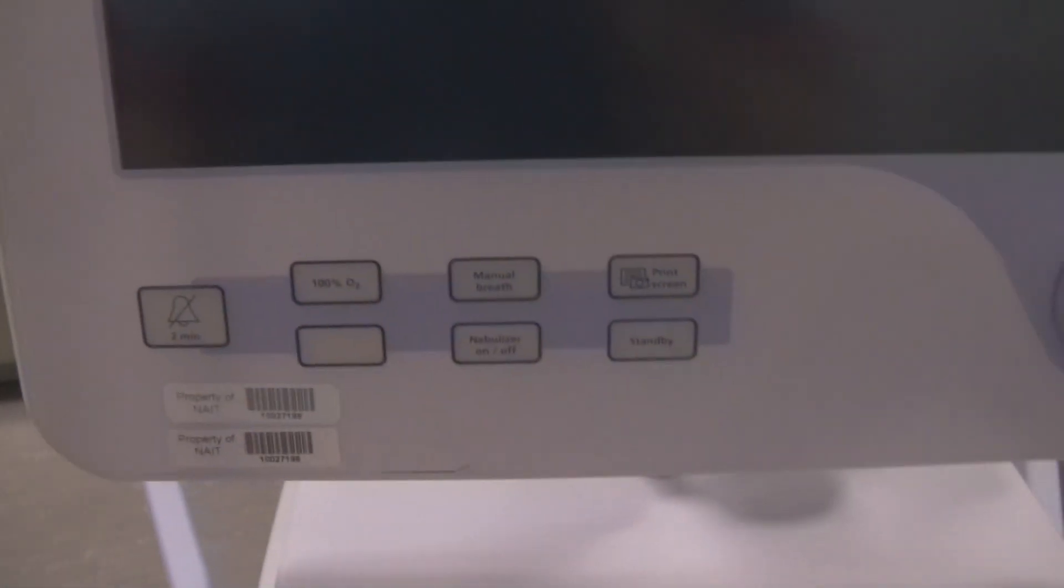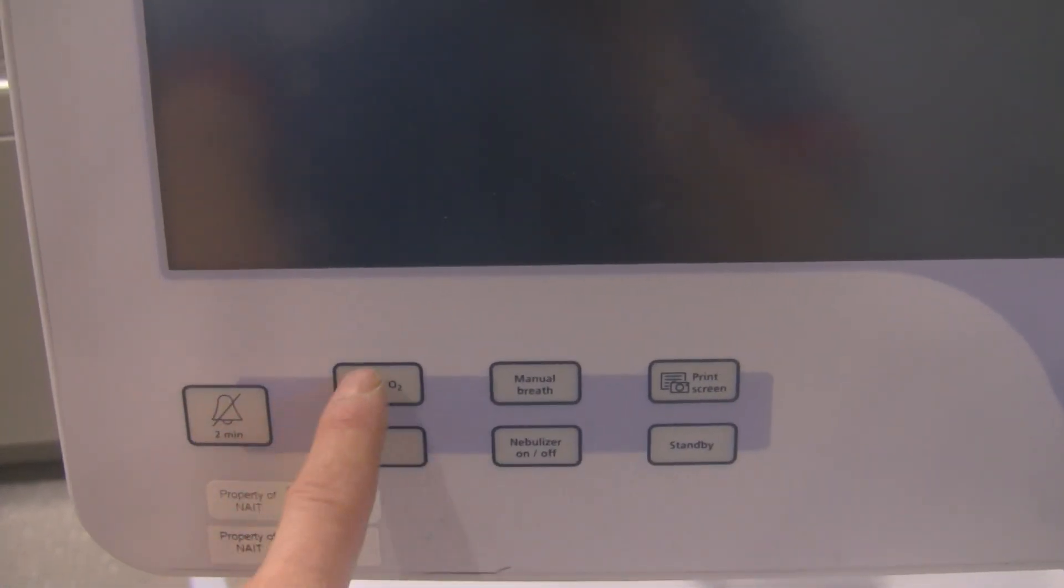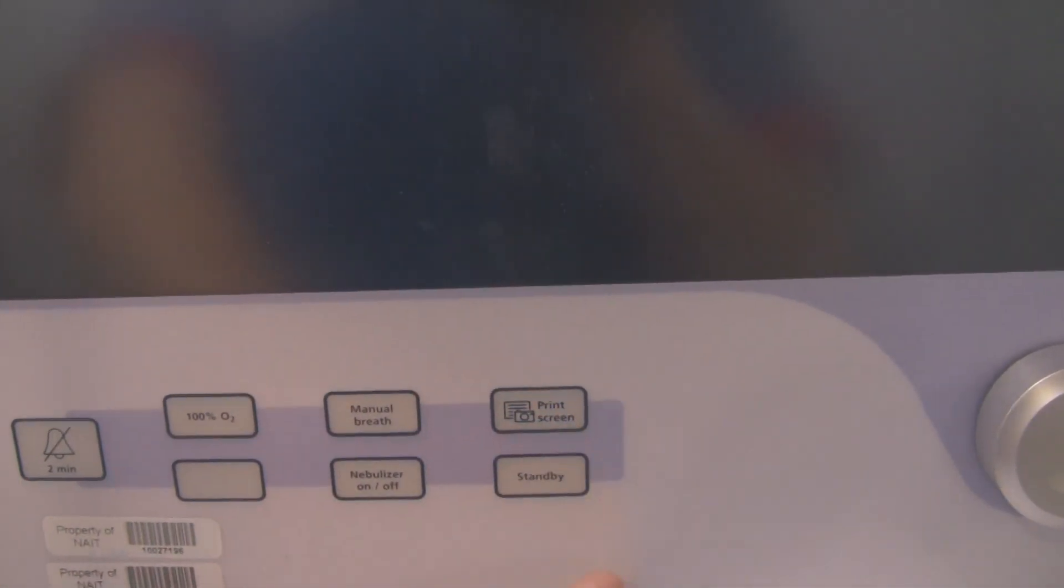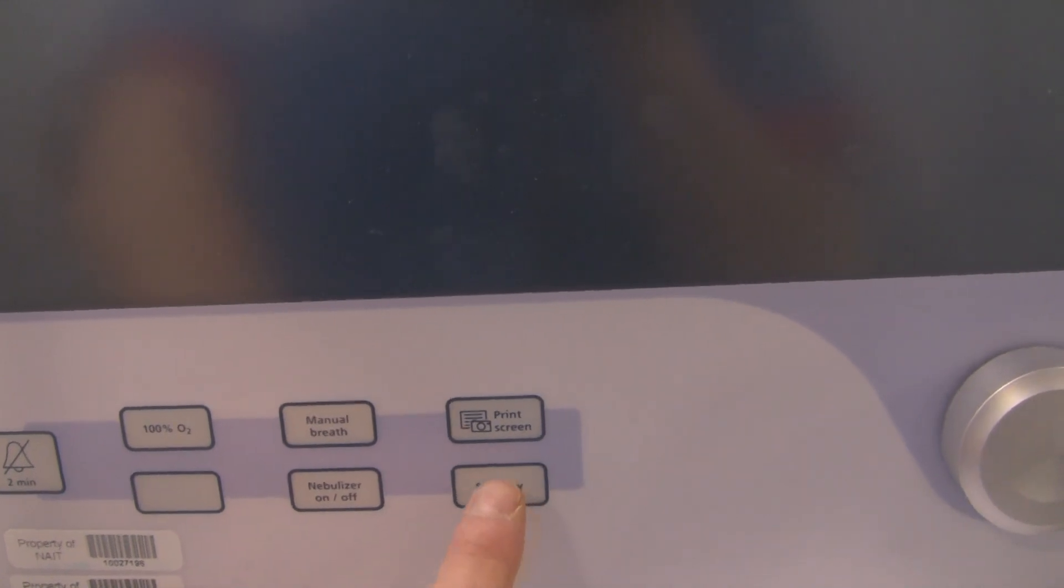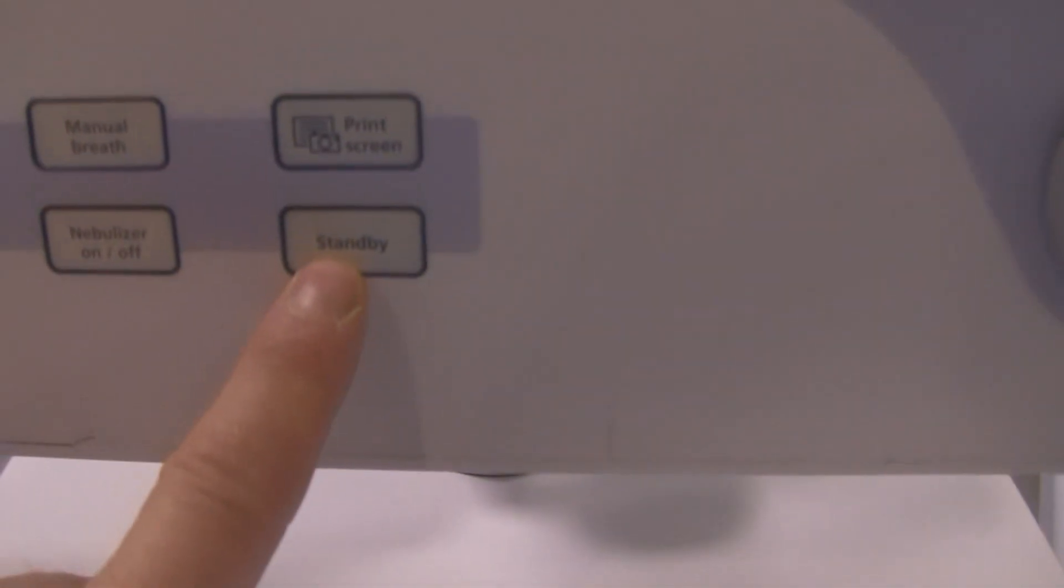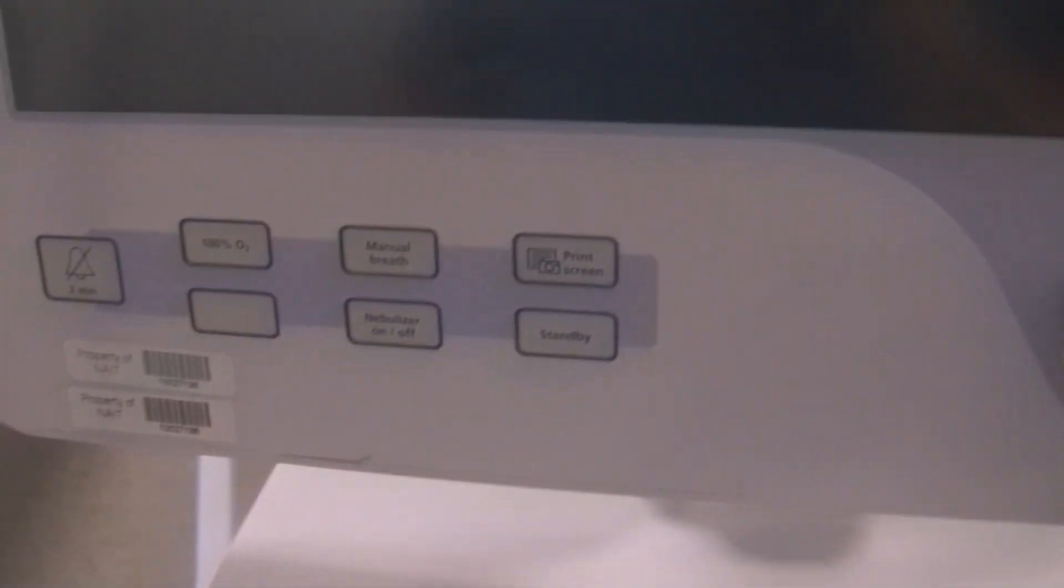There's a couple of soft keys over here that you can also press: alarm silence, 100% oxygen, manual breath, nebulizer, print screen function, and of course if you want to put the ventilator into standby you touch this to put the ventilator into standby and then accept it as well.